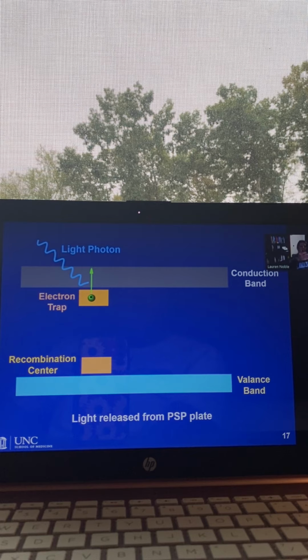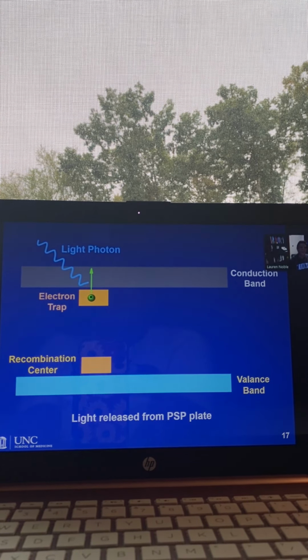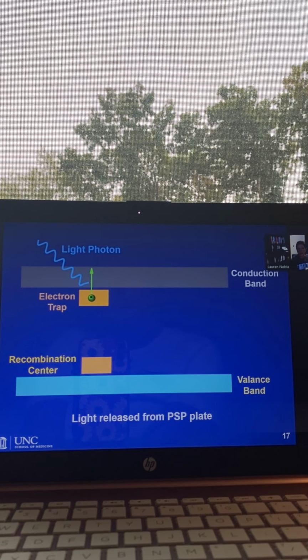Those electrons would fly out of their shells, but then immediately come back down and recombine with the barium fluorohalide, or even go into other atoms and fill voids there, and we would lose our image data. And yes, they would give up light, but we don't want the light to be given up before we can get our receptor over to the processor, because this light is our image data.